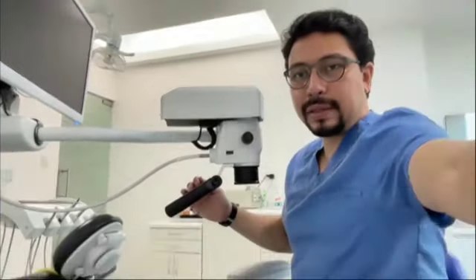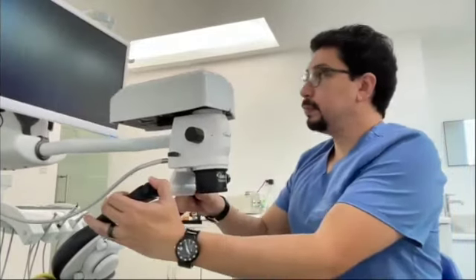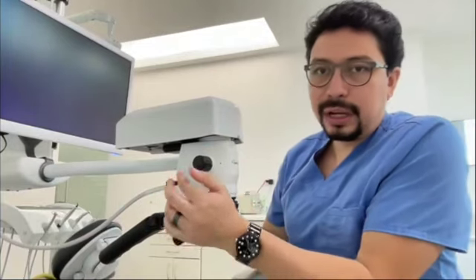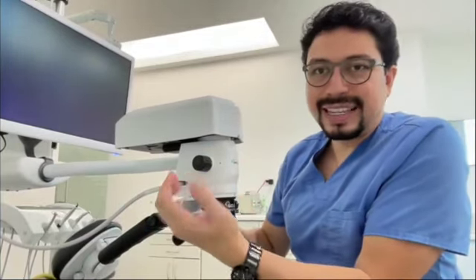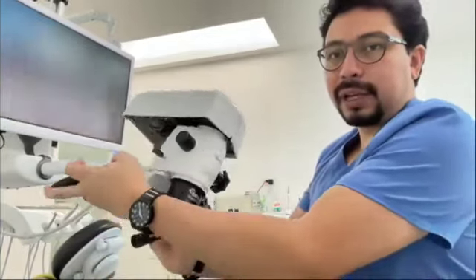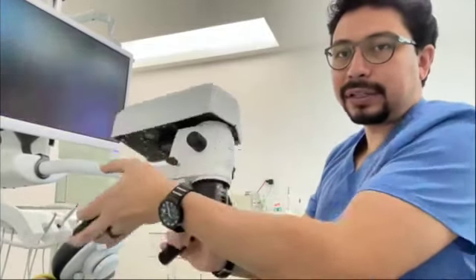I can change the position of the handles. For me, this position is the most appropriate because it's not interfering in your way of movement when you are exchanging instruments with the dental assistant. This is the optical pod, where we change the magnification, where we select the filters, and you can angulate the optical pod in any direction.